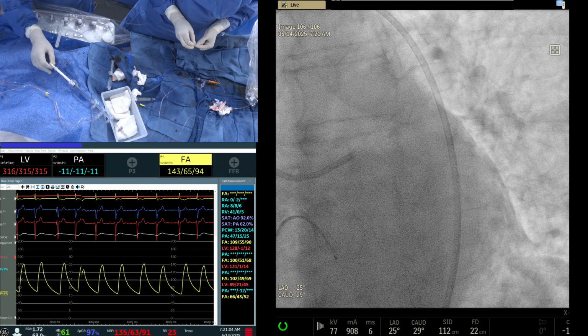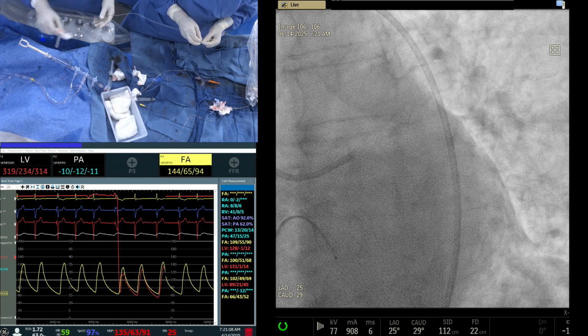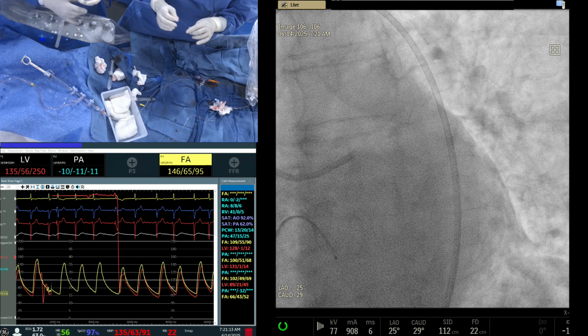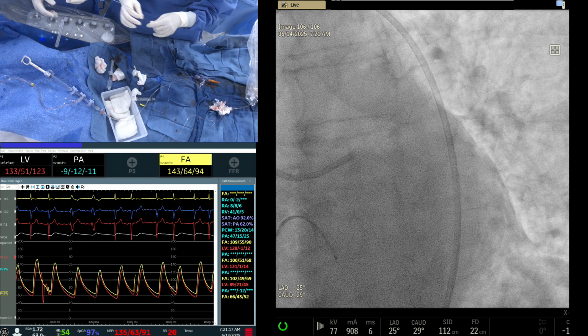So that basically is the region. As I said, 18 millimeter you use, 18 or 20. Women we use 18, men 20, and just dilatation, not that over, with a syringe, and that's what we are able to do here.